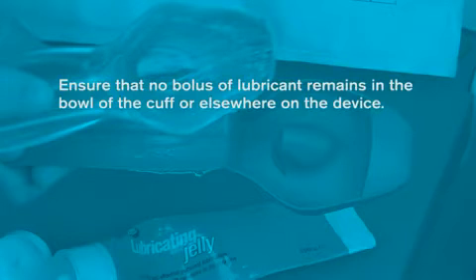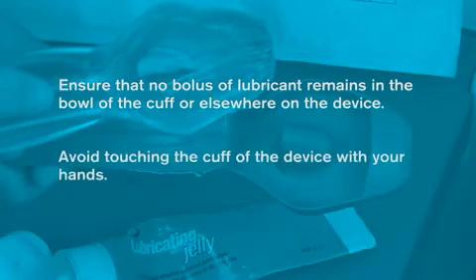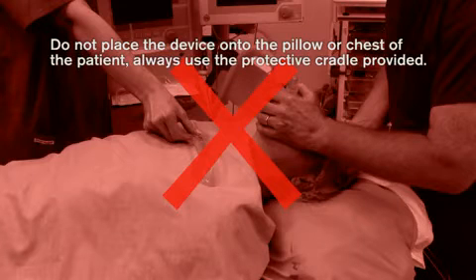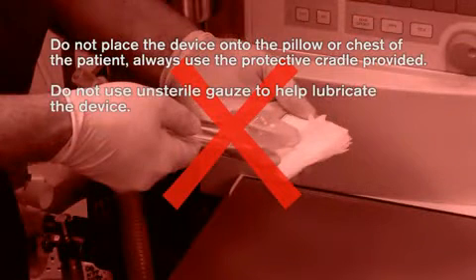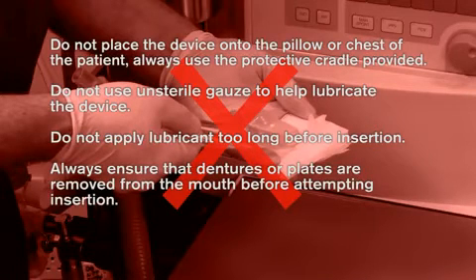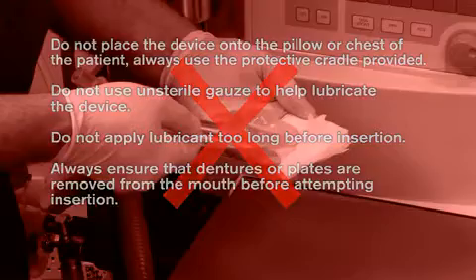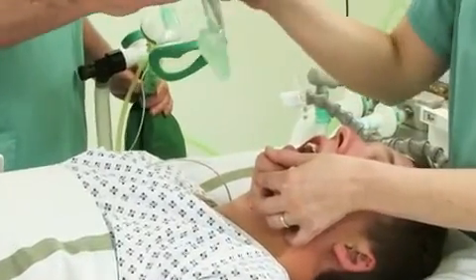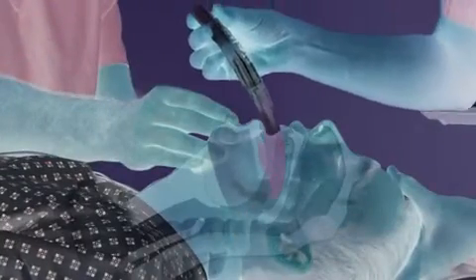After lubrication has been completed, ensure that no bolus of lubricant remains in the bowl of the cuff or elsewhere on the device. Avoid touching the cuff of the device with your hands. Do not place the device onto the pillow or chest of the patient, and always use the protective cradle provided. Do not use unsterile gauze to help lubricate the device. Do not apply lubricant too long before insertion, and always ensure dentures or plates are removed from the mouth before attempting insertion. The device should now be inserted according to the manufacturer's instructions for use and taped down maxilla to maxilla.